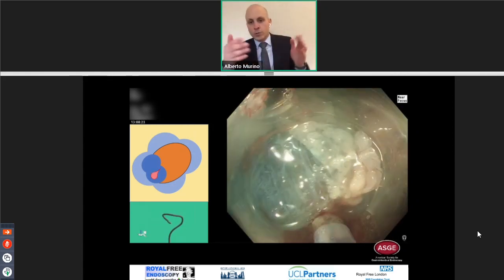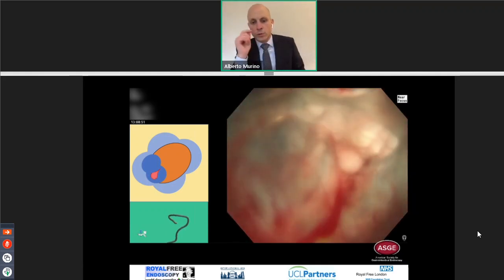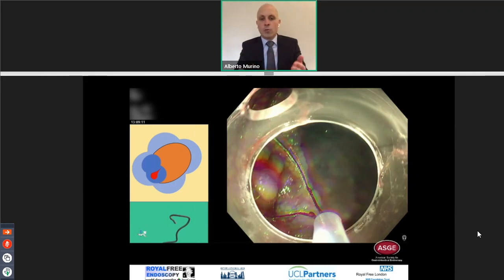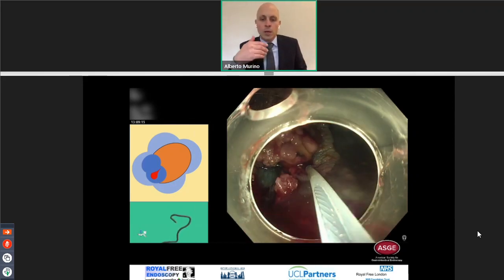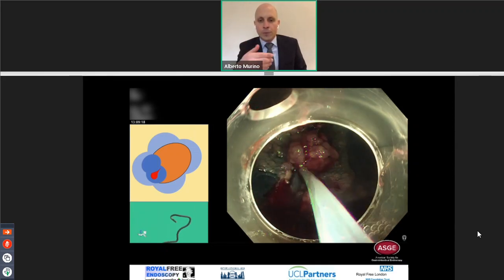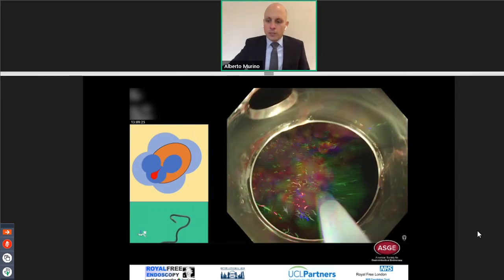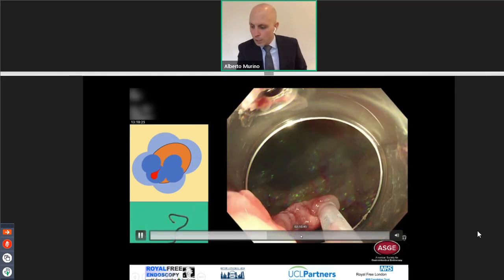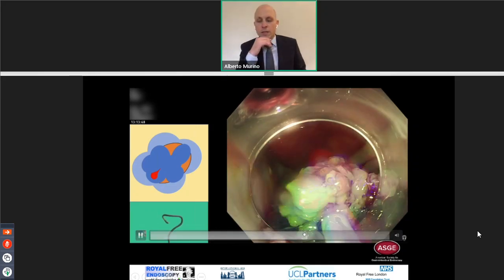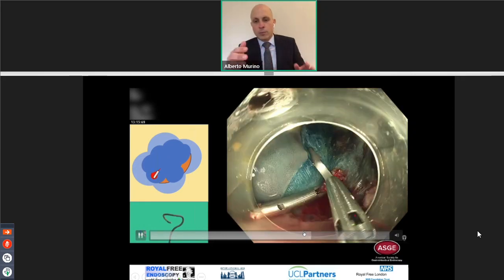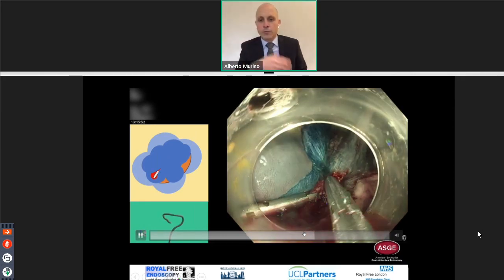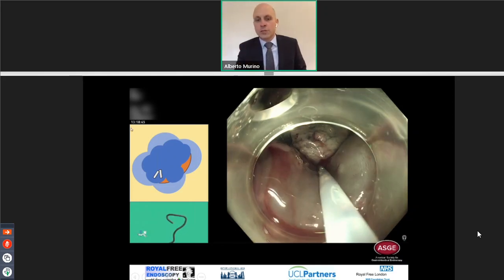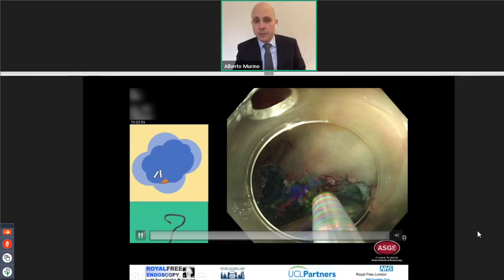As he almost finished his resection, he found the bleeding point very easily with all the space available. He put a few clips, stopped the bleeding, and completed the resection. Everything was handled very well. This was not a complication — this was an incident. But it became a complication the day after, because the patient came back to the hospital. That day I was in endoscopy, so I took care of the complication. I could see the bleeding point and placed a clip, but unfortunately my clip didn't work very well — the lesion was still bleeding.